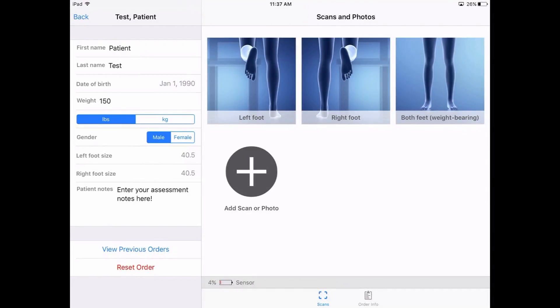The following is a brief tutorial on how to take a full weight bearing scan with the orthogenic scanner. On your patient file, tap the both feet weight bearing image.